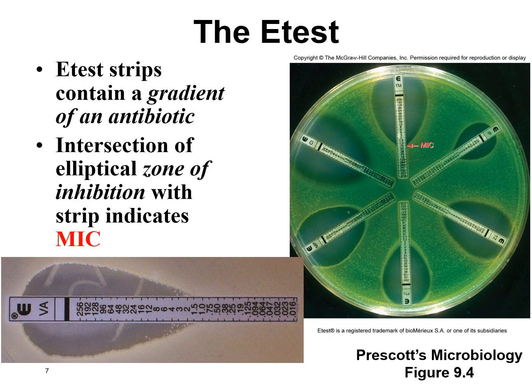Another way to determine the MIC for an antibiotic is to do the ETest. So we'll take the bacteria from the patient's culture sample, put that onto a petri dish, and put these ETest strips on the dish and grow that for 24 hours, then come back. The antibiotic will diffuse out from the test strip and kill the bacteria, and you'll get the zone of inhibition, this clear area. The test strip has different levels of antibiotic, and you can see that marked on this test strip on the bottom for vancomycin.